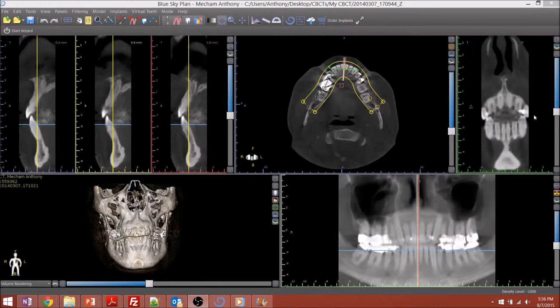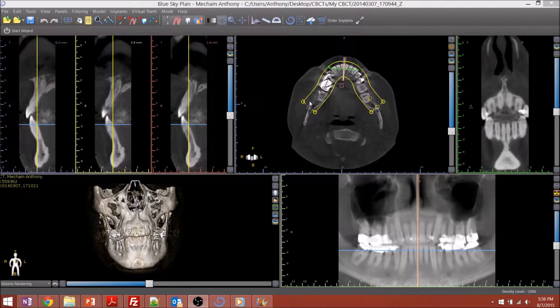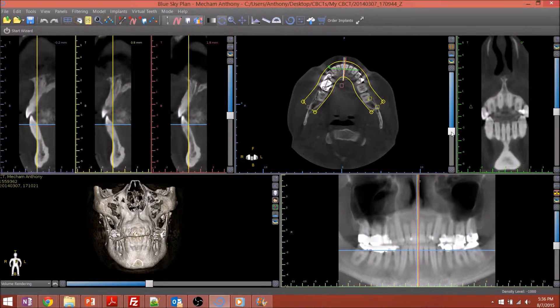I'm going to be showing you Blue Sky Bio's Cone Beam CT imaging software. It's called Blue Sky Plan, and it's by Blue Sky Bio, an implant company. I just found out about this today, and it's free software for viewing your cone beam data. So I figured I'd give it a try on first glance. It doesn't look quite as nice as I'm used to with Anatomage, but this software is free, so I figured I had to try it.